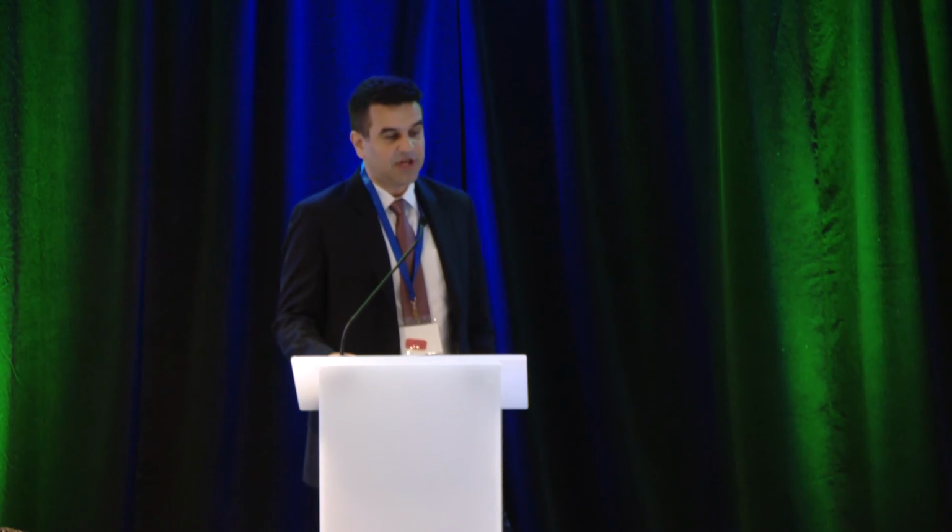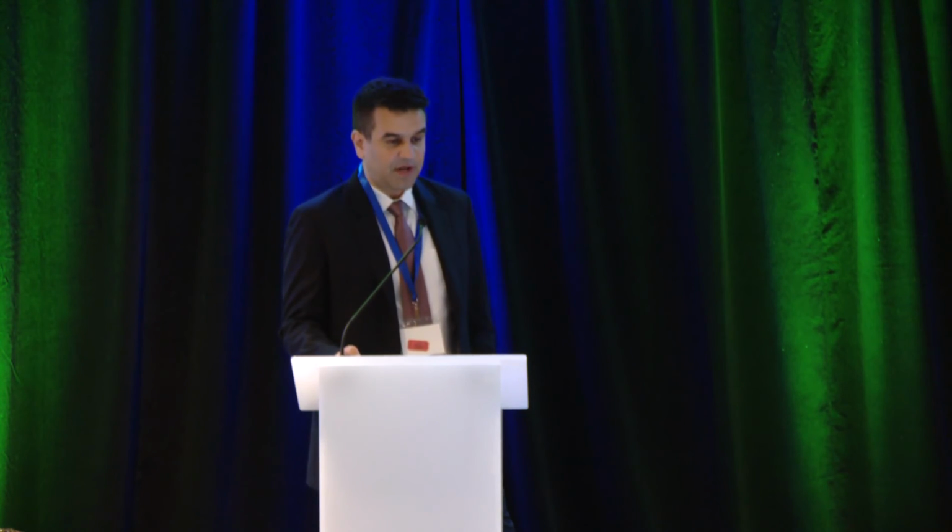And we'll get to EGJ outflow obstruction. But if you meet criteria at the same time for EGJOO, you would classify that as EGJOO with spastic features, which may represent an achalasia variant of type 3.